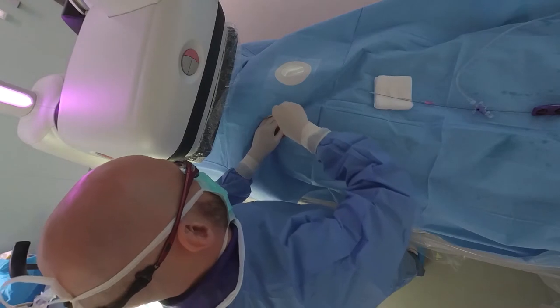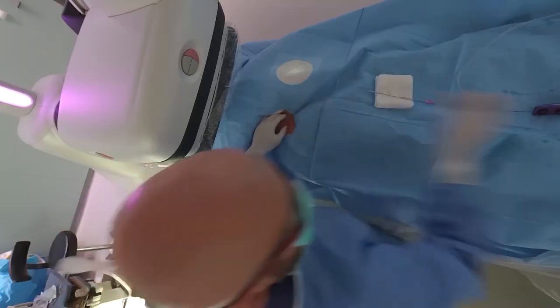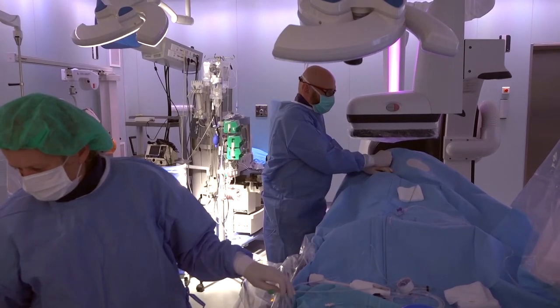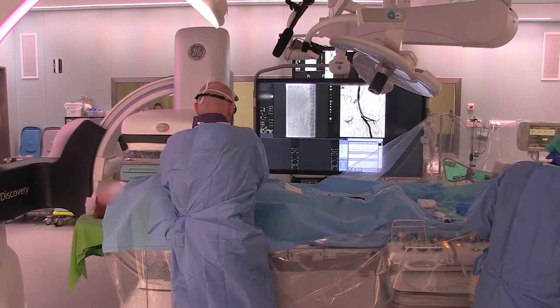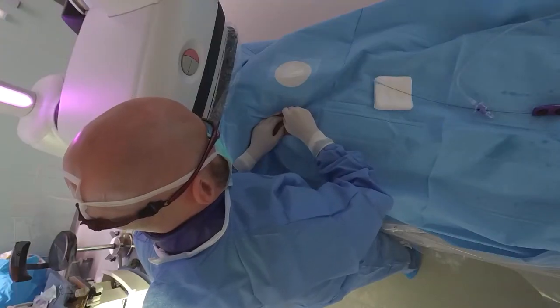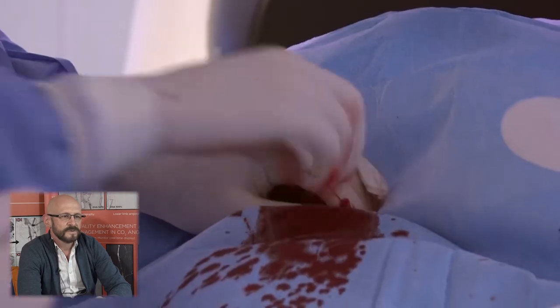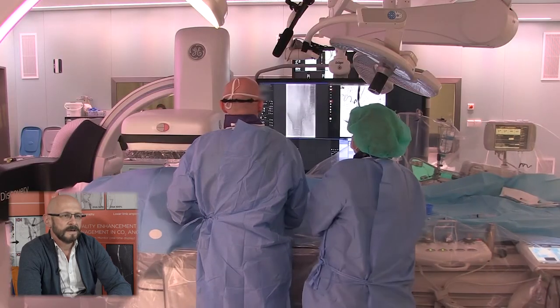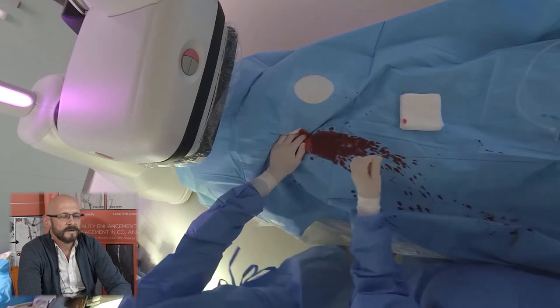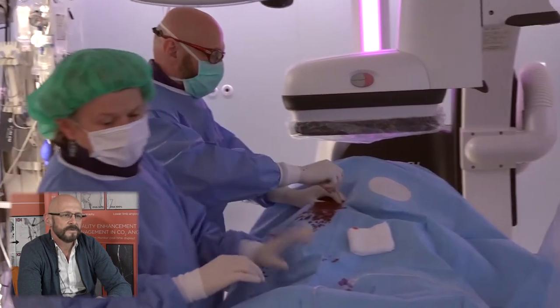This is the right femoral access. To engage the left iliac system, we used a four French contra catheter. When we engaged the left common iliac artery, we advanced a 180 centimeter long hydrophilic wire.